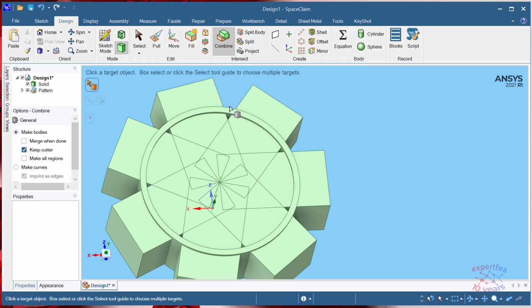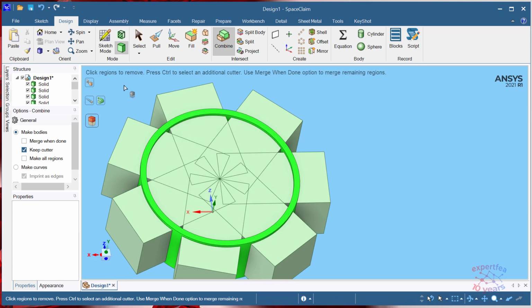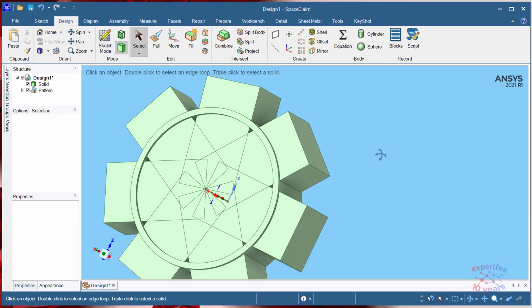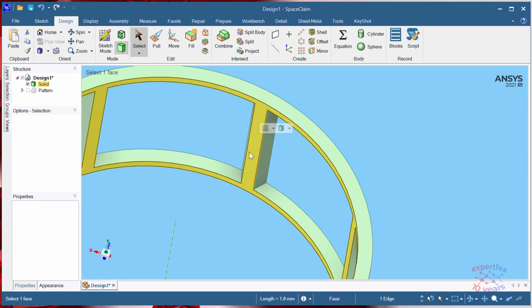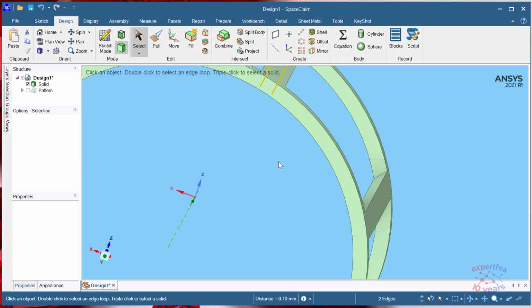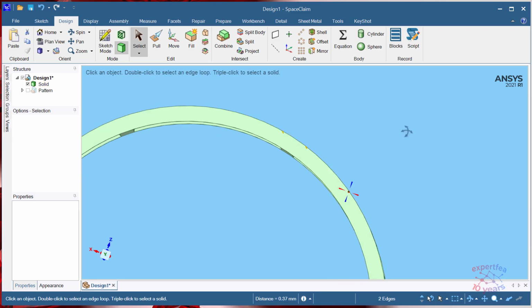Combine, select a target, click a target object. Cylinder is the target. Then click the pattern bodies. It says click regions to remove. Inside there are some small red pink windows. So escape to get out from the command. Let's hide the pattern. I will click here, and we have some struts. If I'm checking the distance here, we see that it's pretty big, 0.19. This means that the outside, with Control pressed, it's 0.37. It's pretty big.